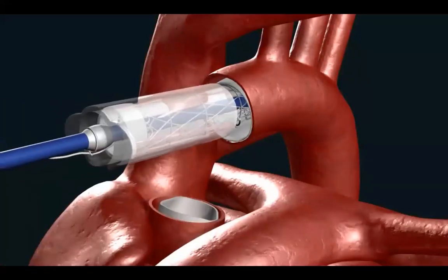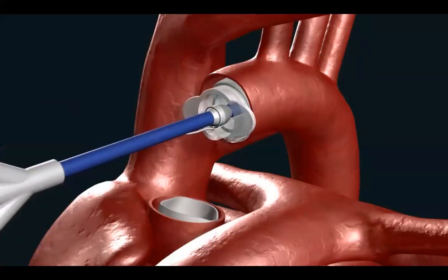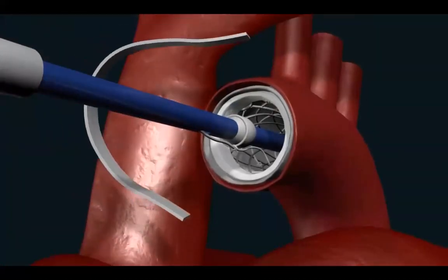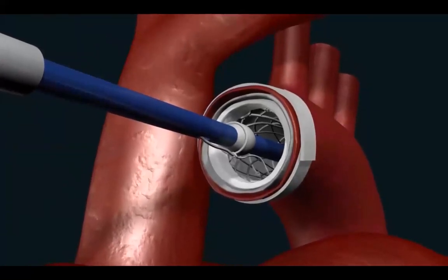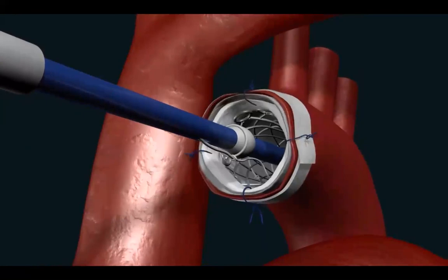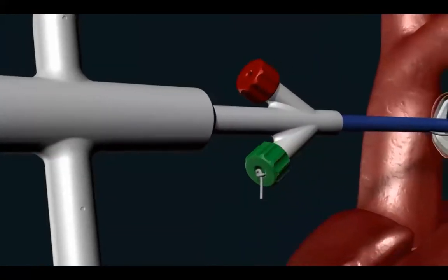And then you bring the PTFE cuff flush, and you remove that device there, and then you see the cuff there. It's not deployed as of yet, and they do recommend using a felt strip around. Some do, and then, like I said, you tack it down with 4 sutures just to stabilize it and ensure it doesn't move. And then it's deployed. We're pulling this green knob.